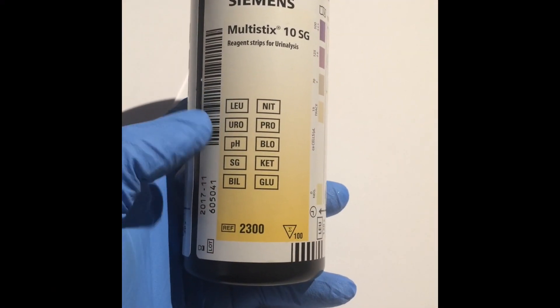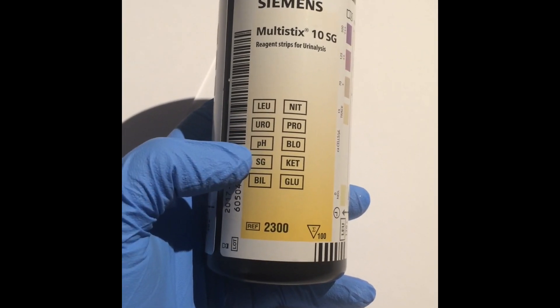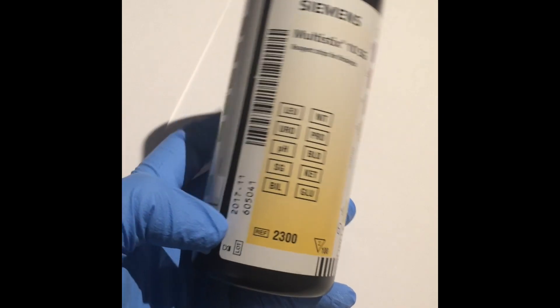Here are the parameters being measured: leukocytes, nitrites, urobilinogen, protein, pH, blood specific gravity, ketones, bilirubin, and glucose.